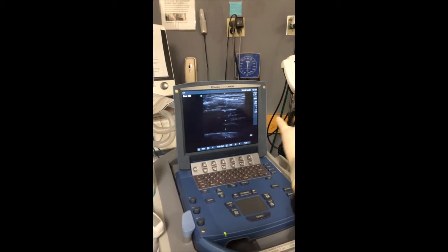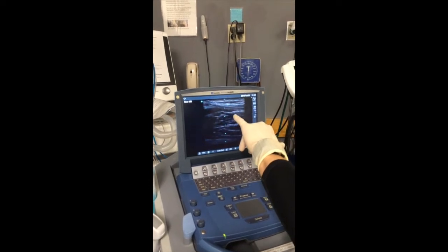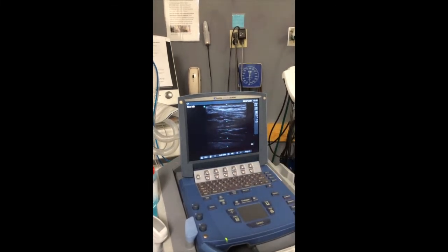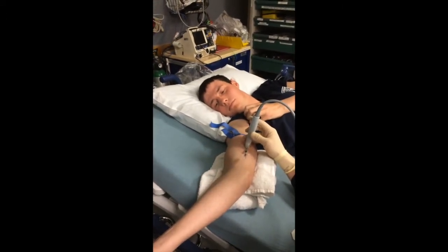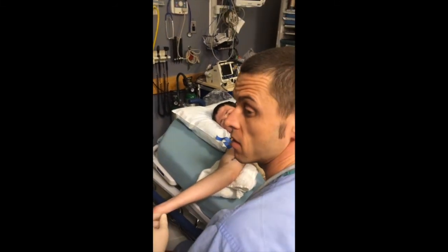You just keep threading that through and the needle's out. There's the catheter coming in through the vein — see, I can compress it. There it is, a beautiful shot right there of it — there's your vein traveling along, catheter's coming in. And if you look down, you can obviously see I've got the flash and it's in, and then you're just going to finish your normal IV procedure. So that's a quick take on inserting an IV with ultrasound guidance. Thanks a lot.